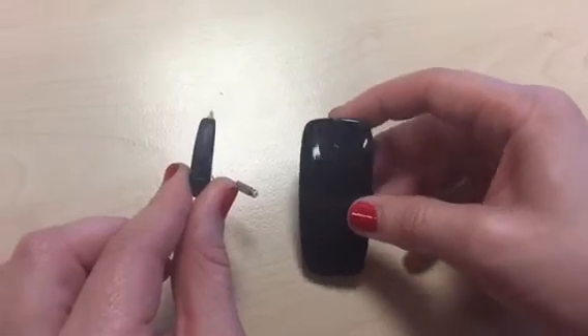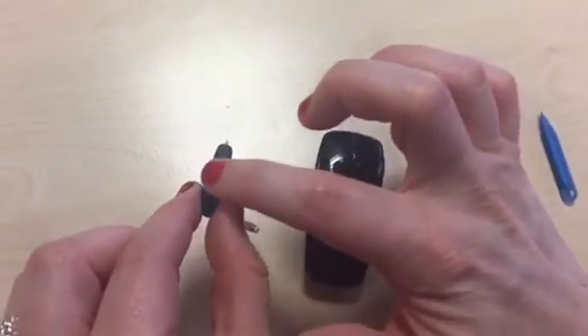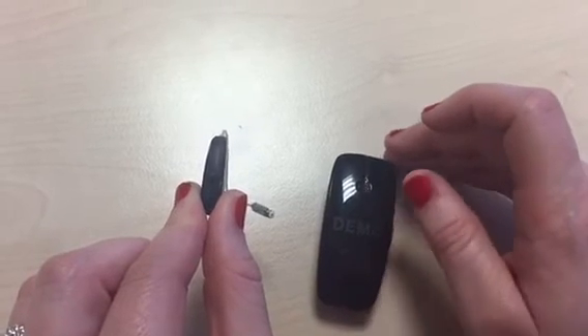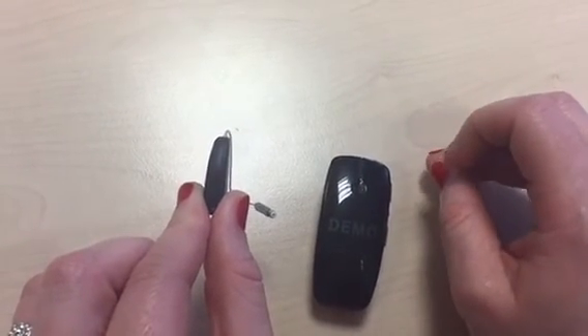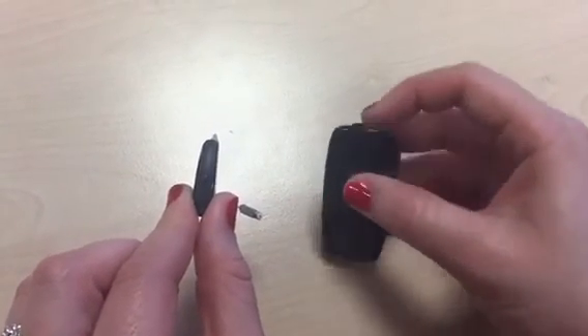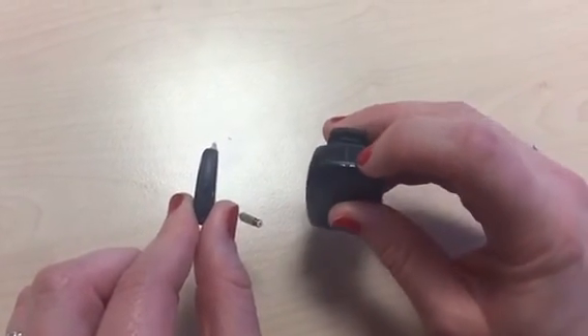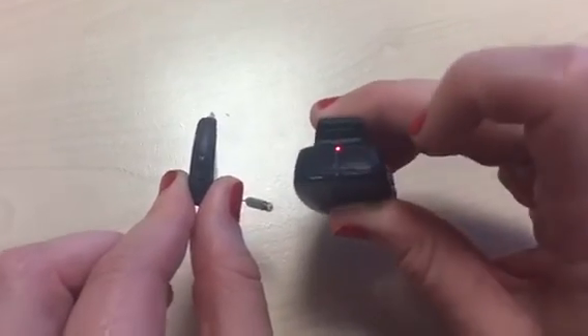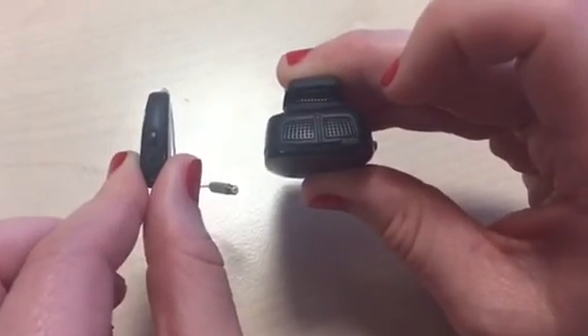When you have finished, simply press on the button once quickly to return it back to normal and it will beep once to show that it is no longer connected. Alternatively, you can simply just turn off the multi mic by pressing down on the power button for 2 seconds, and it will shine red to show that it is switched off.